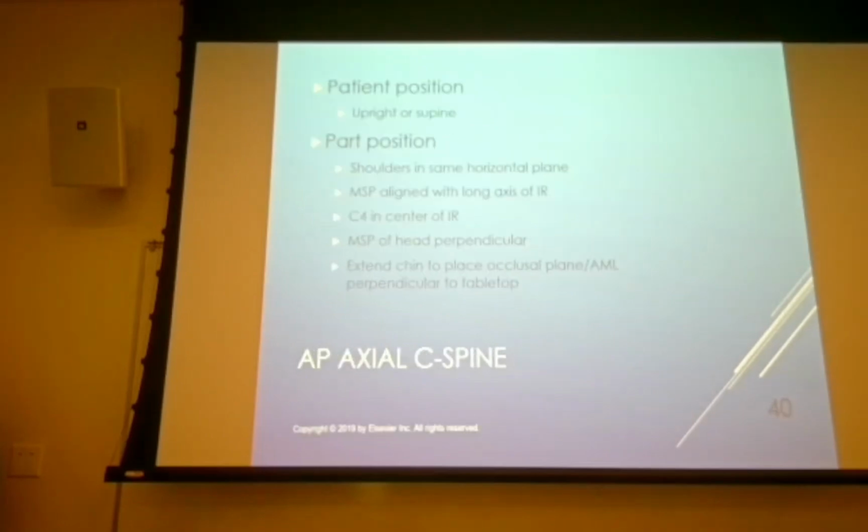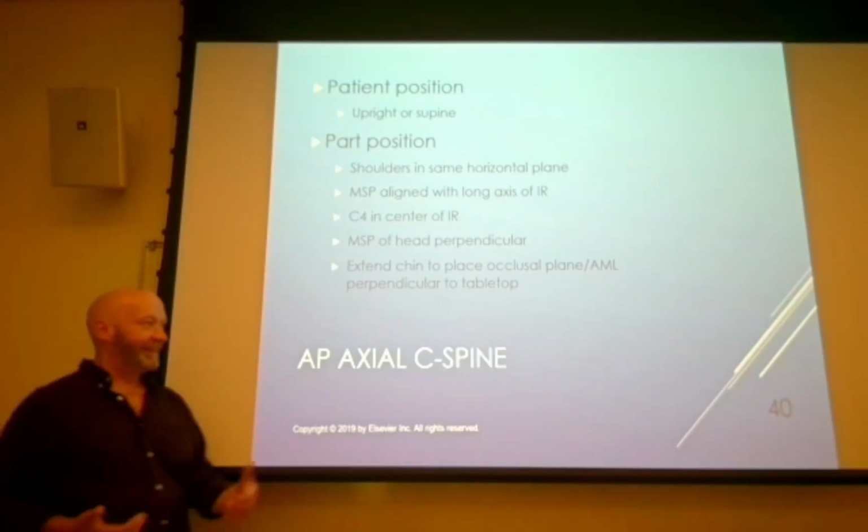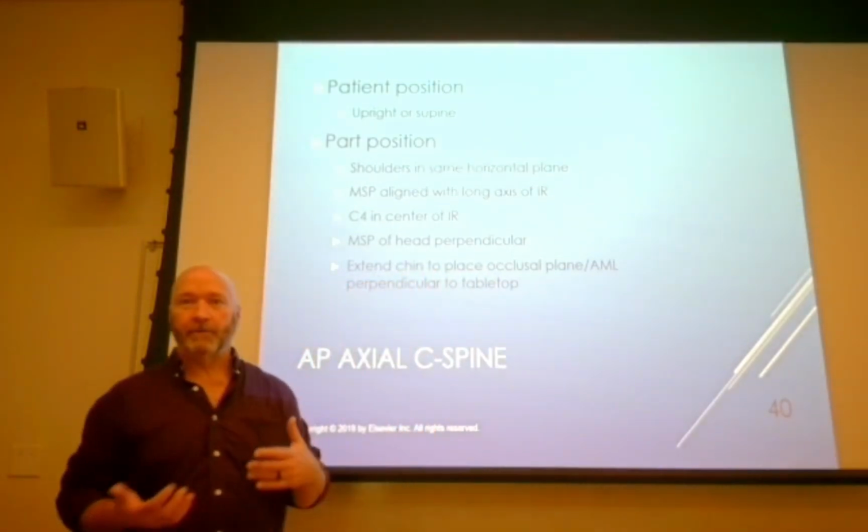Okay. So AP axial. I need a skull, I need a skeleton, I'll use my own head here. All right.